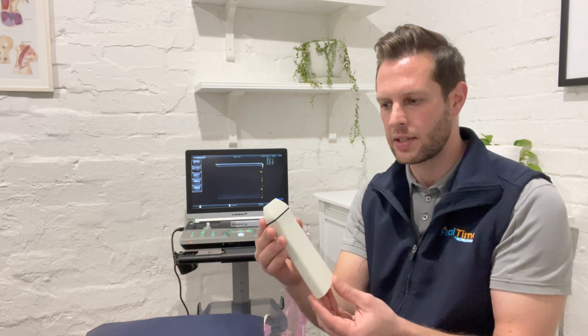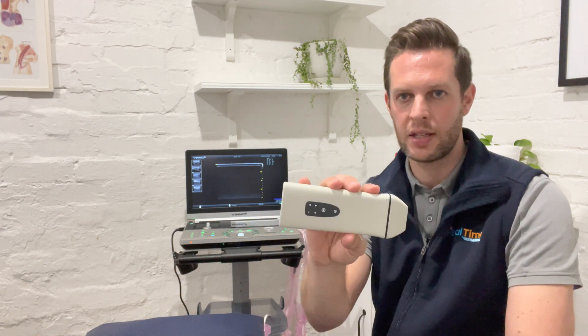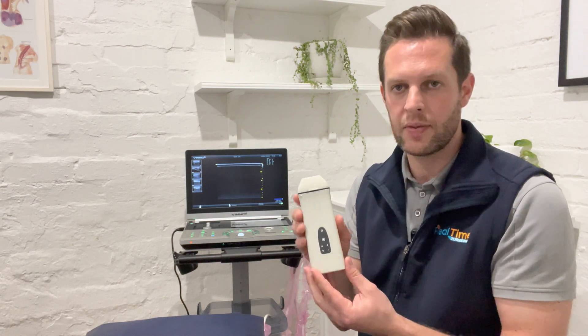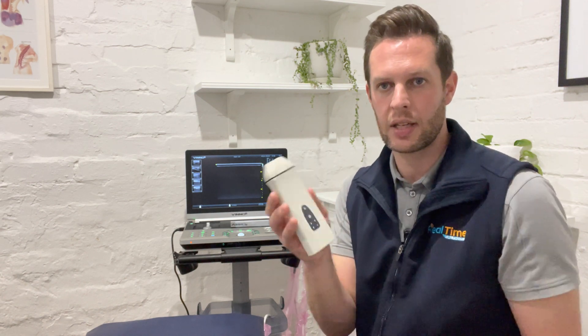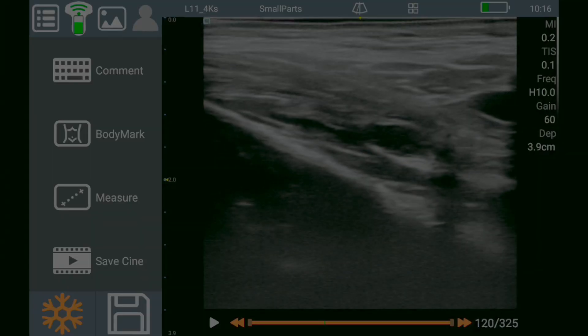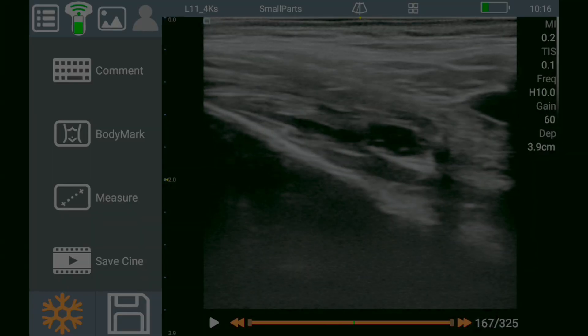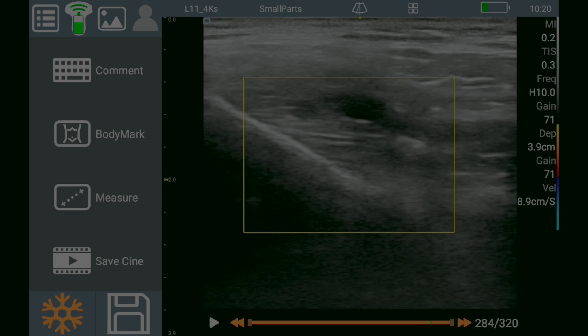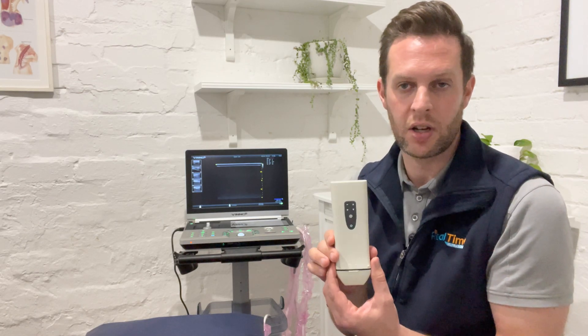So let's talk about some of the different types of machines available. This first one here is the Qsuno D8. This is part of the group of small handheld portable wireless ultrasound machines. The D8 emits its own Wi-Fi signal and you can connect that to an iPad, iPhone, Android tablet, phone, or even a Windows PC. The advantages of these little machines is that they're super portable, don't take up much space, very easy to get up and running — imaging in a matter of seconds — and also they're low cost. Machines like this are around the same price as the cost of a transducer from a more standard ultrasound machine, and they're becoming more and more popular for that reason.